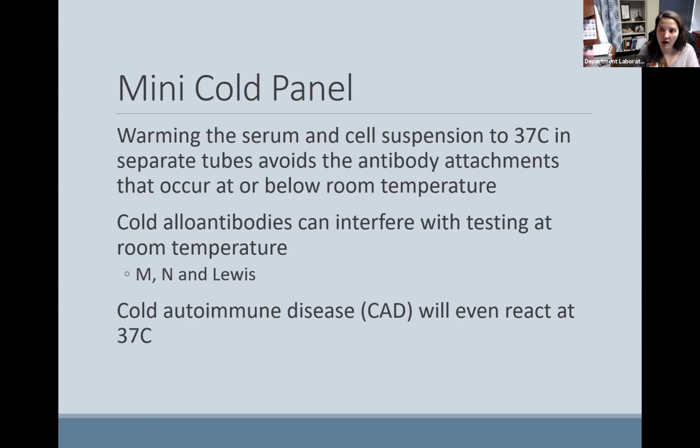Now, whether or not you give anti-M compatible or M negative units, that is debatable and depends. Some facilities will give AHG cross-match compatible units. They will say that is satisfactory. Some institutions will say, no, you have to antigen type those units for anti-M, or I guess antigen type for the M antigen, sorry, not the antibody.